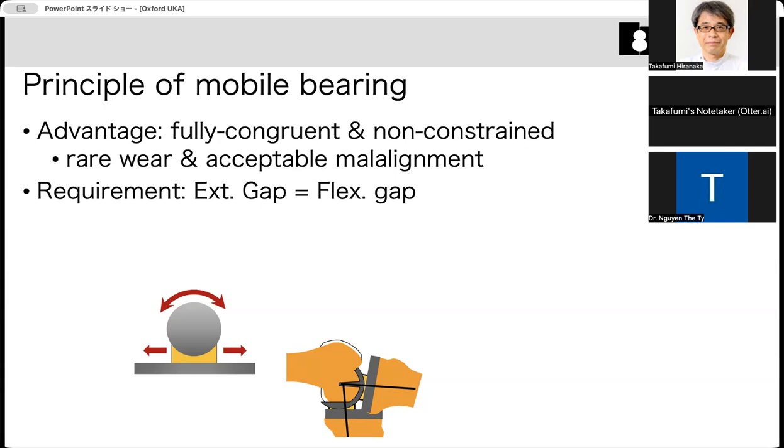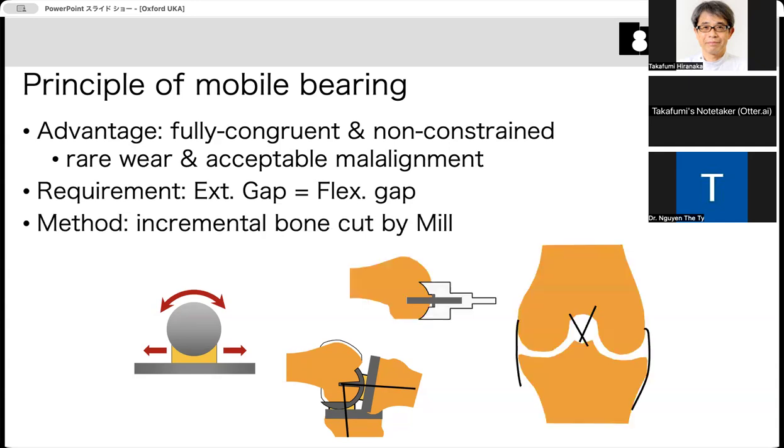The other complications such as infection, lateral osteoarthritis, arthritis progression, are almost similar. But loosening is slightly higher in fixed bearing because of the shearing during the motion. ということになりますね。で、どうして、このようにギャップを合わせるかって言ったら、make the flexion gap first. Then adjust the extension gap accordingly based on the flexion gap.